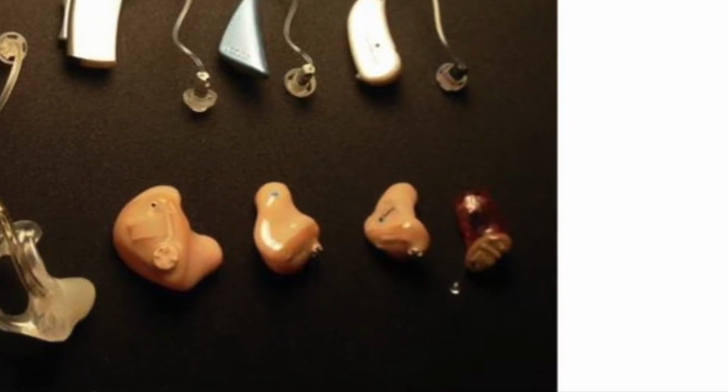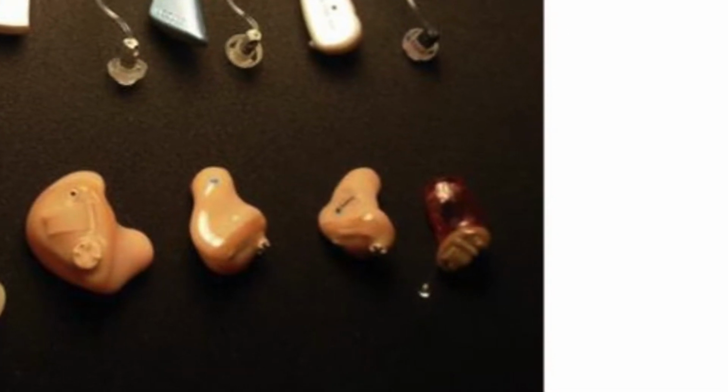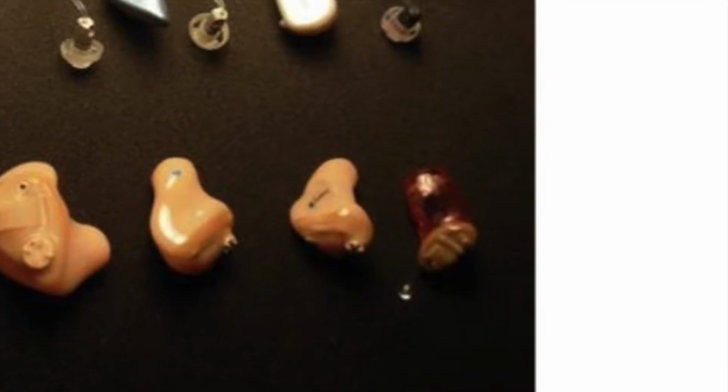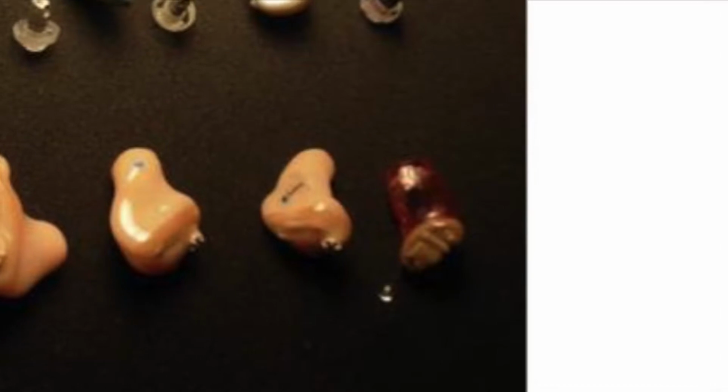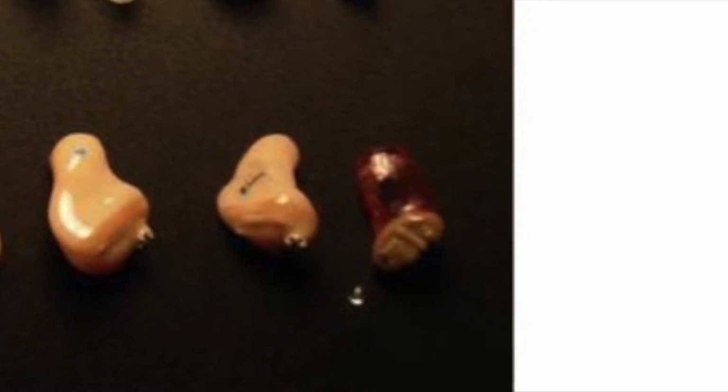We have what we call in-the-ear hearing aids, that fit completely in the ear like this. It's a custom mold. We have a completely in the canal hearing aid, which you can't even see when you're looking at the ear and you're facing the person.